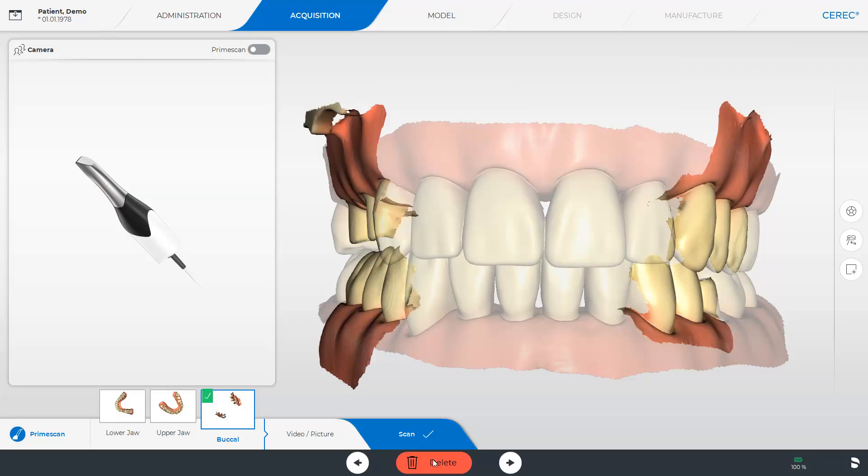Since we want to highlight the variety of export options with the CEREC software in this tutorial we have already performed the individual scans. You now see the preset image catalogs, lower jaw, upper jaw and buccal bite registration.